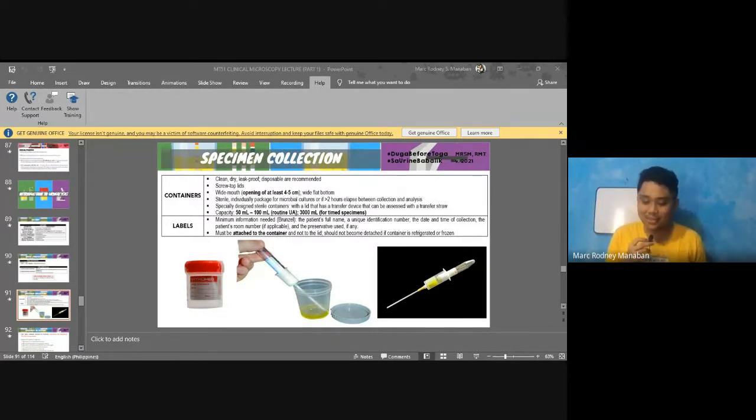Nako, what if wala ta nagklase ron niya, na mo sa hospital niya. Nakadawat mo ginato na. So may yung buhaton di ay. Anyway, the first thing that you should do, dears, basta gani, duha ka requests, and then usara ka specimen, especially sa urine, since we're talking about urine, you have to prioritize the culture. Culture, good atong unahon.